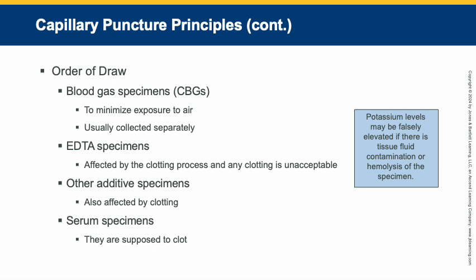Potassium levels may be falsely elevated if there is tissue fluid contamination or hemolysis of the specimen. Specimens for newborn screening should be collected separately and from a separate puncture site.